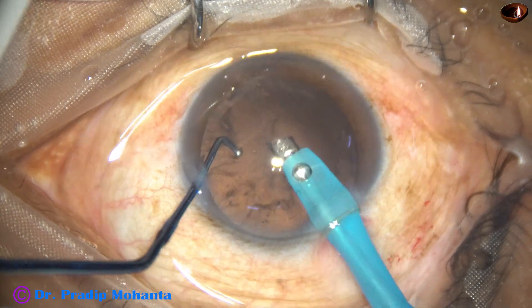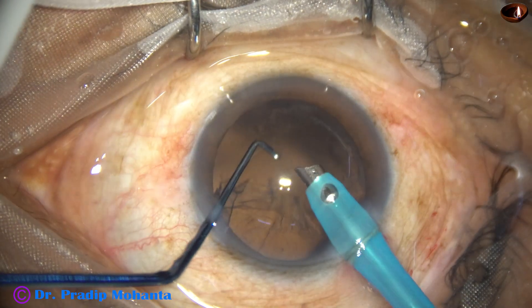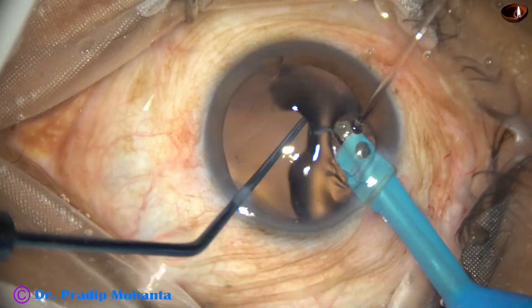This is the first video clip. Nowadays I try to remove some cortex by the handpiece itself, and most of the time I can do that.